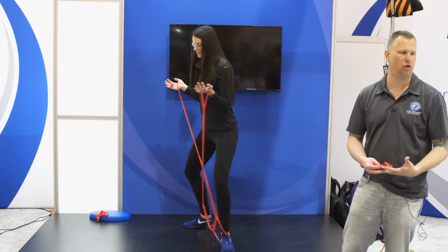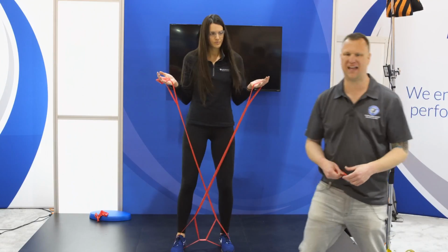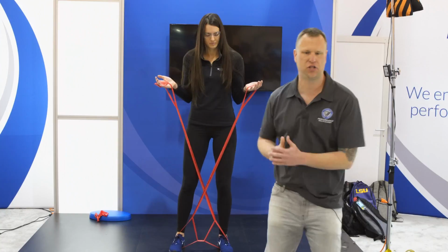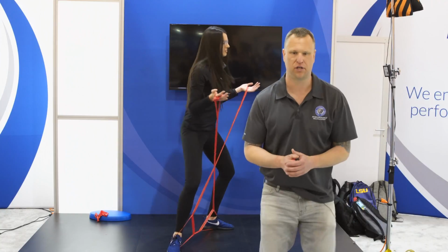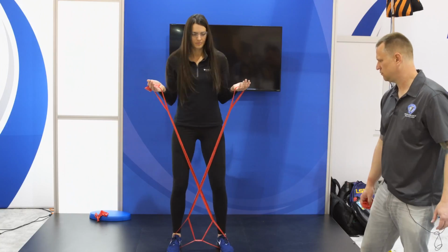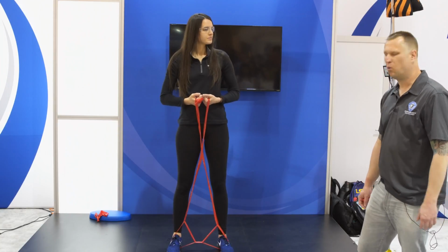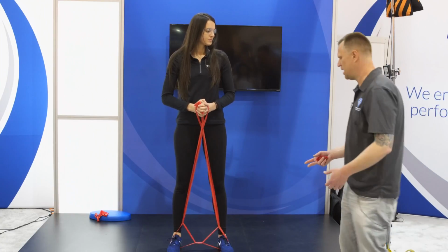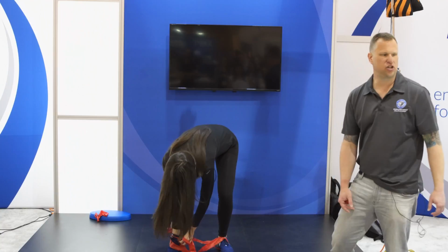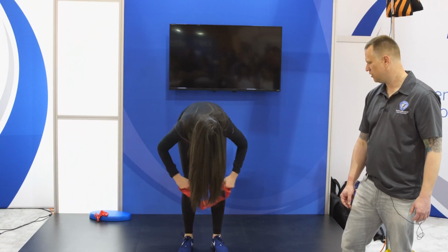What is the patient's goals? Are we treating both sides? The answer is yes. We can do that to that side. We can stay closed chained again on hypothetically her right-sided issue and drop step to the other direction. Drop step to the other direction. Okay, so just different ideas. What if that was a little bit too challenging? Could we not slip that up around the knees and essentially shorten the lever arms? And I'd hope the answer to that is yes.